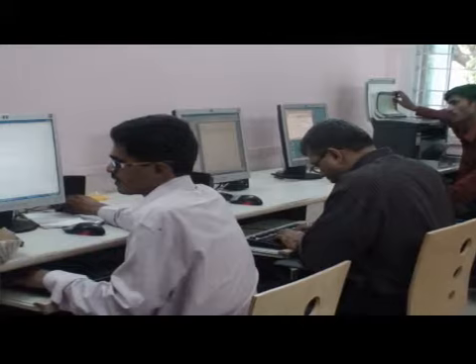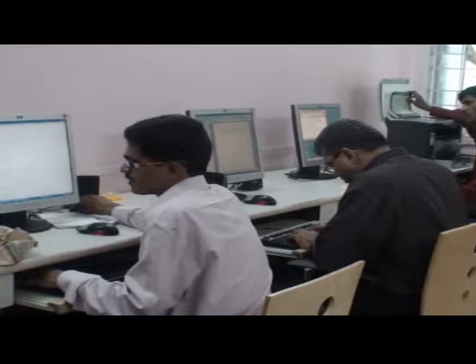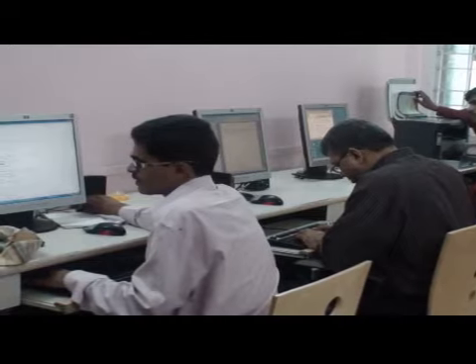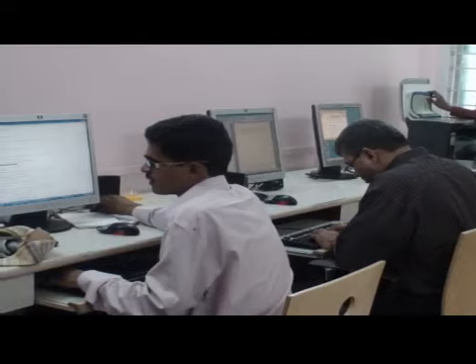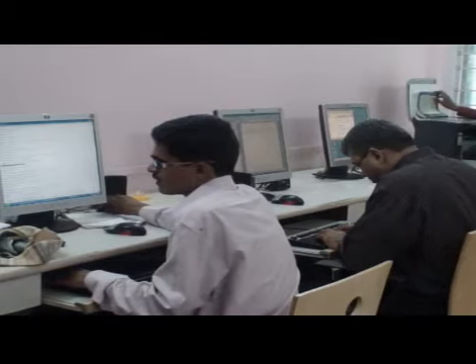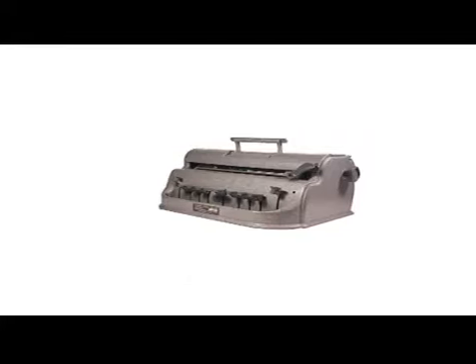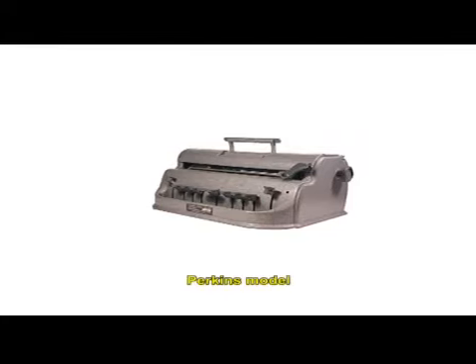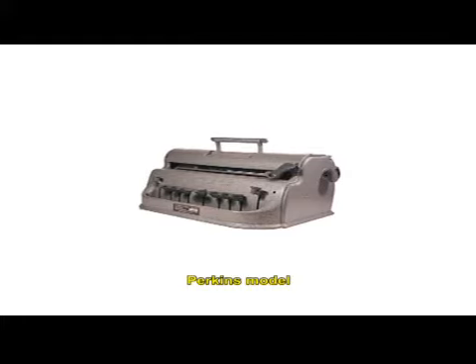While this combination of software and hardware can be used by people who are blind, it is most often used by those who transcribe written materials into Braille. This technology combination allows Braille transcribers to produce larger quantities of Braille than they can with a manual Braille writer such as a Perkins model. This helps to create a much larger library of materials for Braille readers.